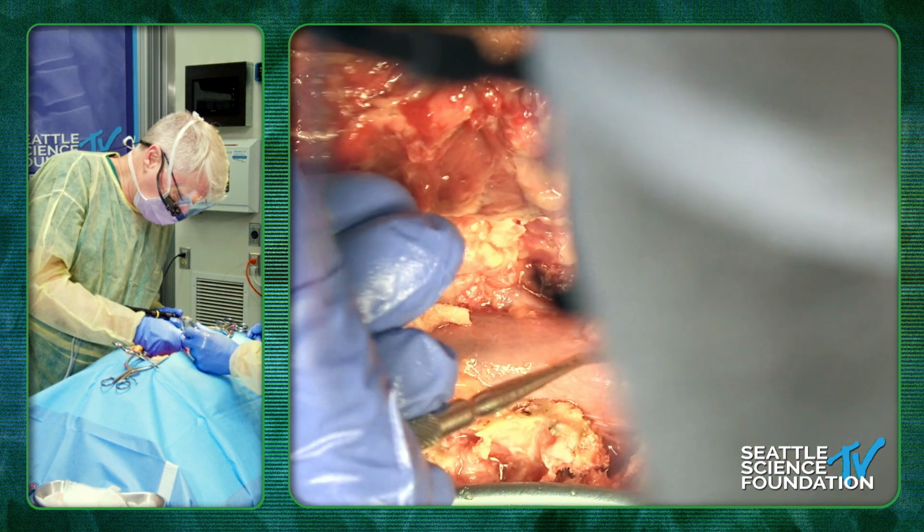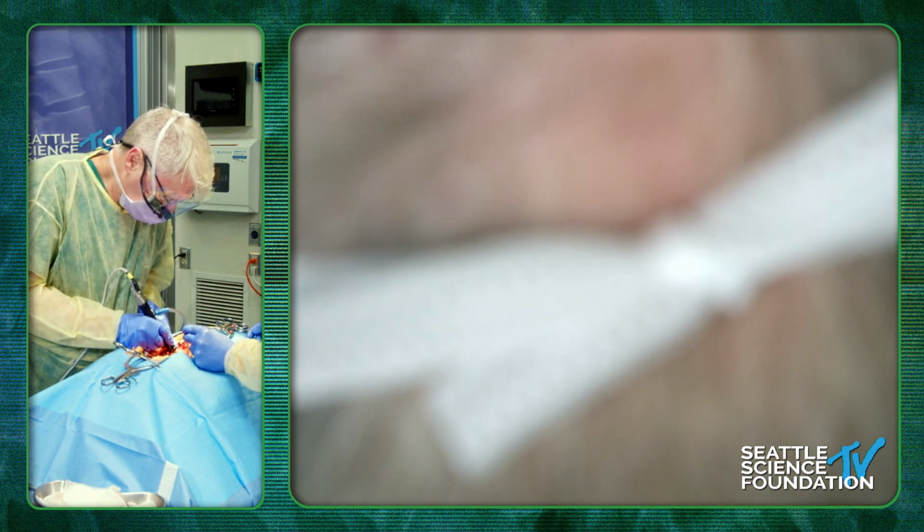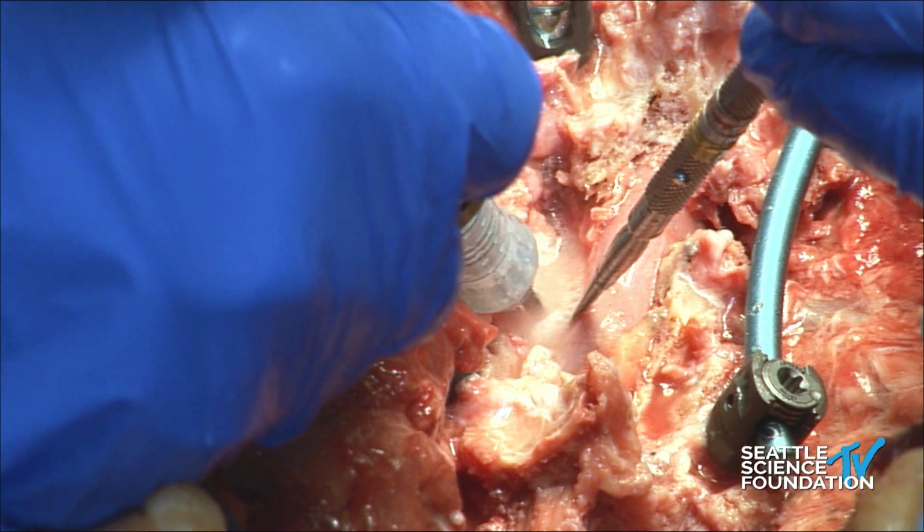Okay, so I want you to take the nerve root gently. Don't show Dr. Chapman. We can't see. Your head's in the way.